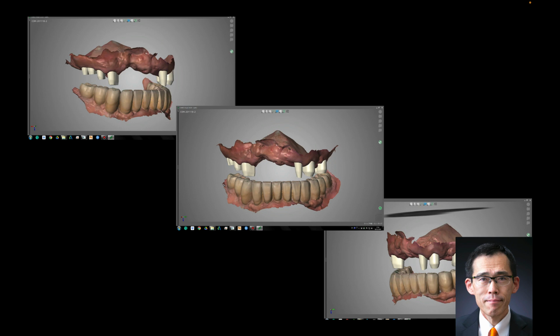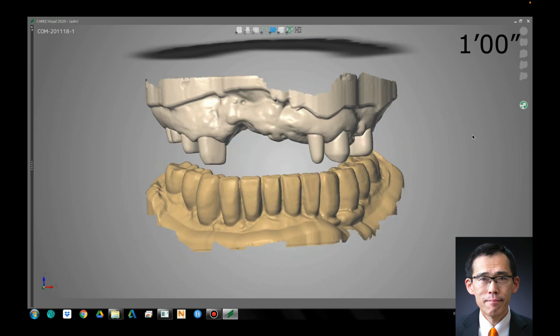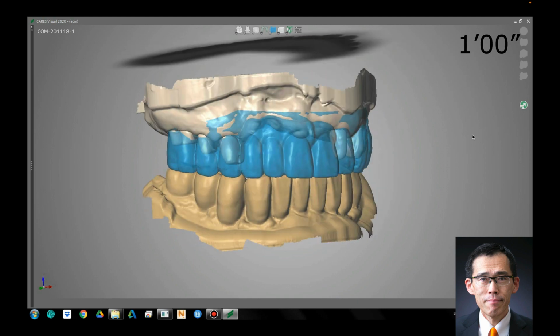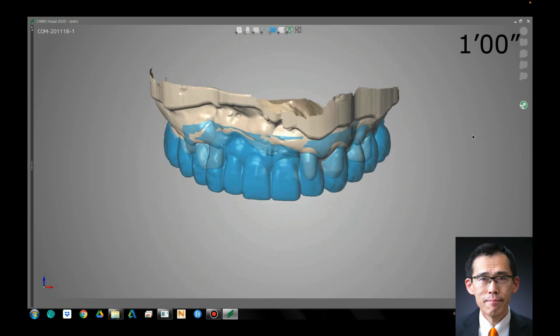After digital impression with Trios, CAD design of the inner zirconia was performed. After designing the inner crown, the outer PEEK bridge was designed with CAD-CAM software.